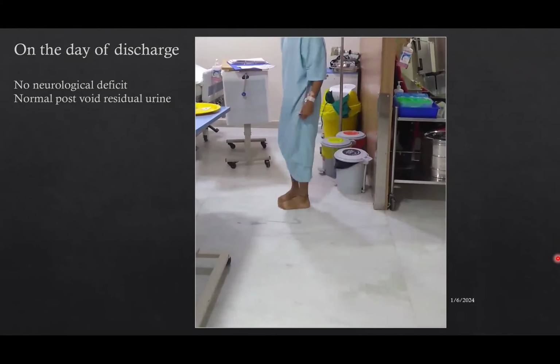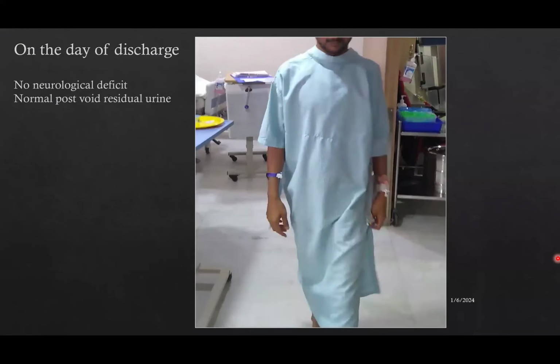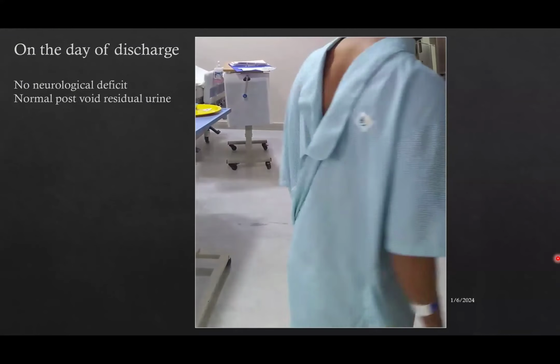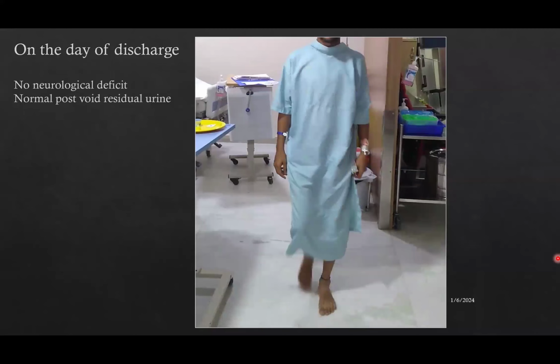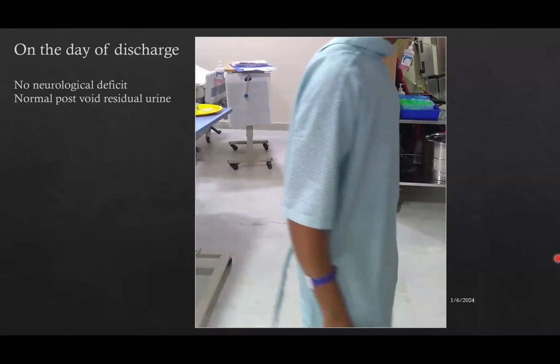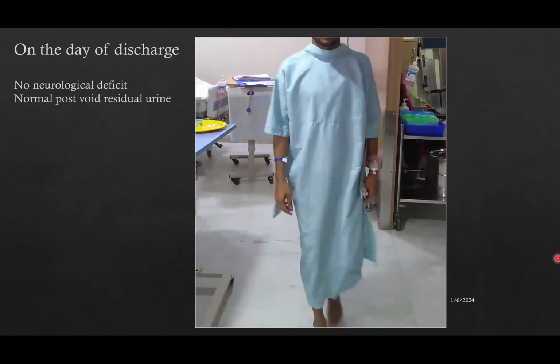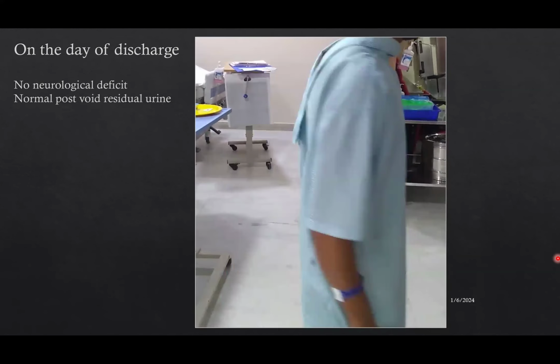The patient also had a follow-up angiogram, done 2 years after his embolization. The follow-up was done after 2 years because I also treated his pelvic AVM in a staged manner. So in his last staged embolization of the pelvic AVM, a spinal angiogram was also performed, which showed no recurrence of the spinal vascular malformation.